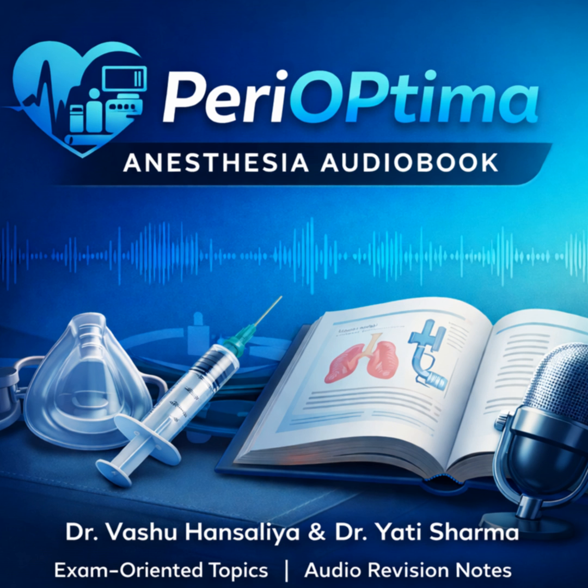And it all starts with one fundamental equation. Ah, the equation of motion. This looks like something from a physics textbook, but it dictates everything we do in the ICU. It absolutely does. It's Pmus plus Pvent, elasticity times volume, plus resistance times flow. Okay, break that down for me. What does that actually mean at 3 a.m. with a crashing patient? It's simpler than it looks.